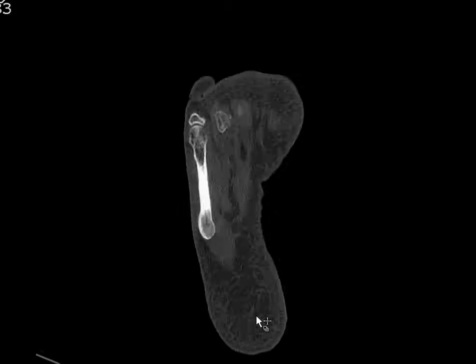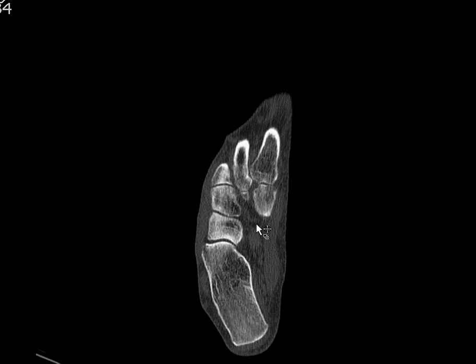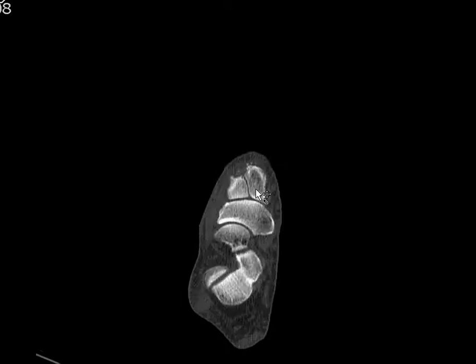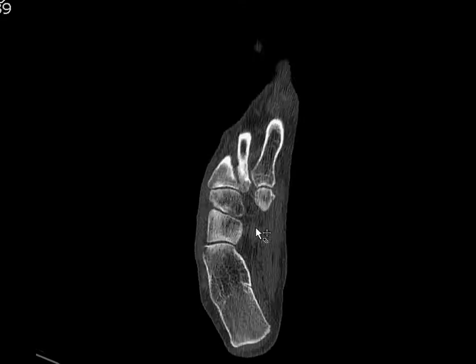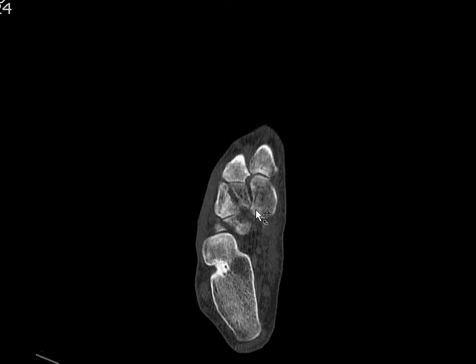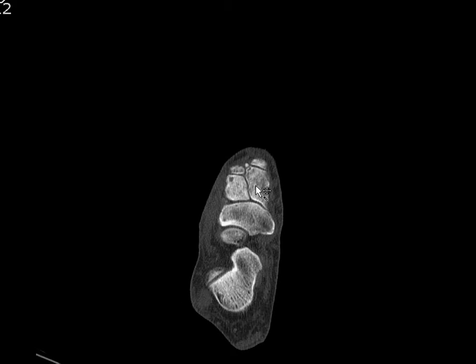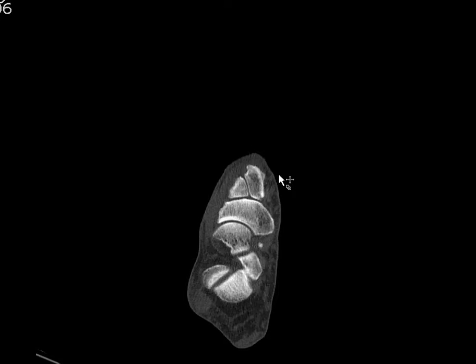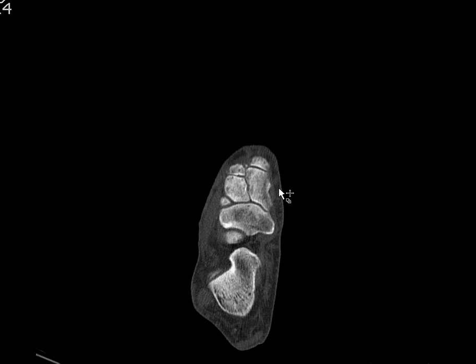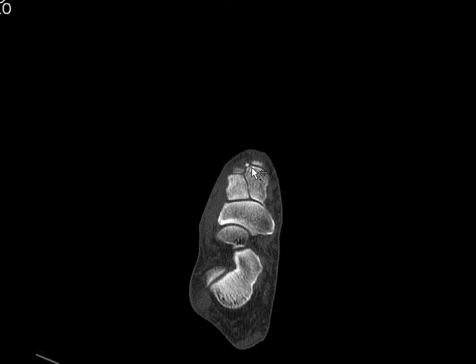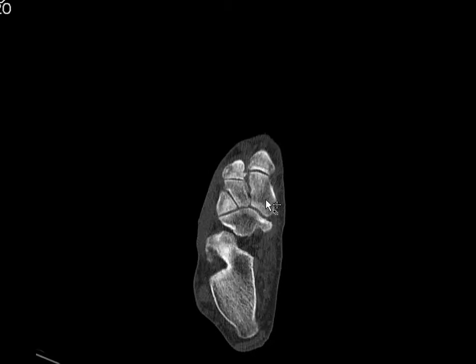We're going to review imaging planes for a forefoot CT. This whole foot and ankle were obtained for this purpose, but in this case it was someone with forefoot pain, and in fact they have a little bit of fragmentation here.